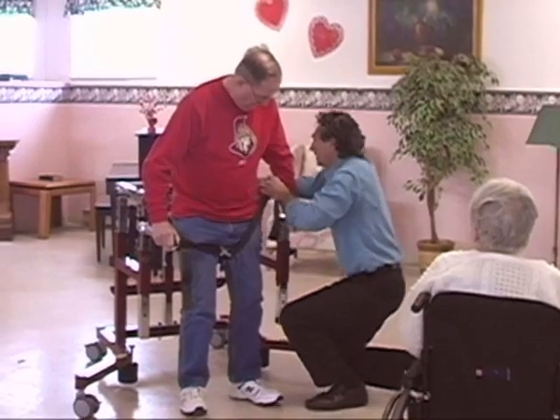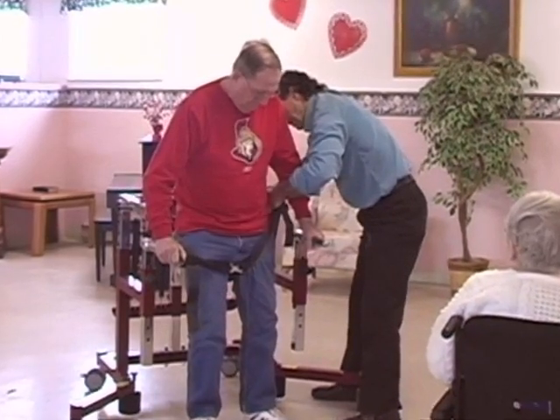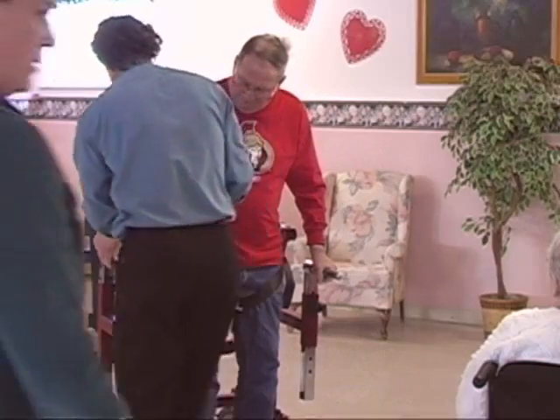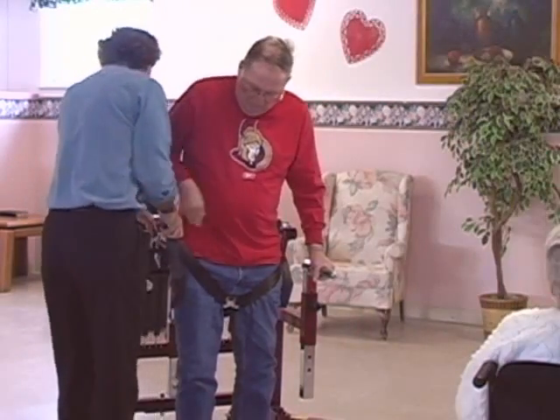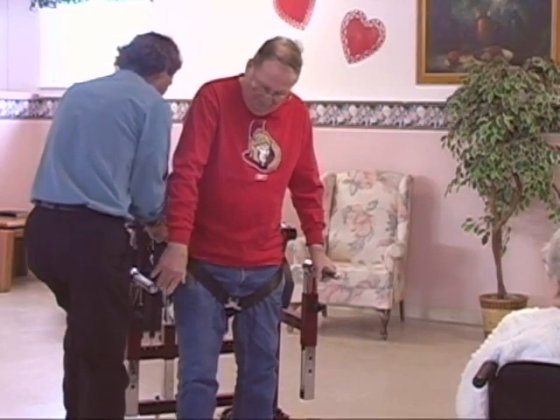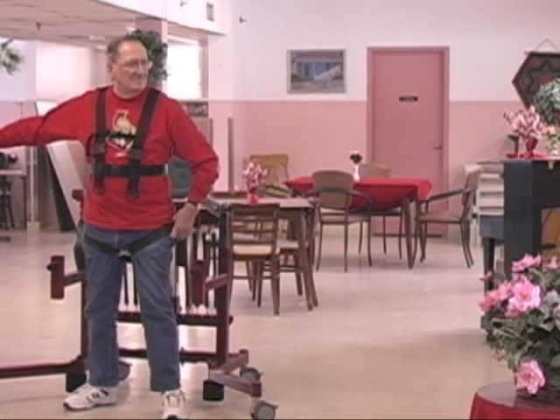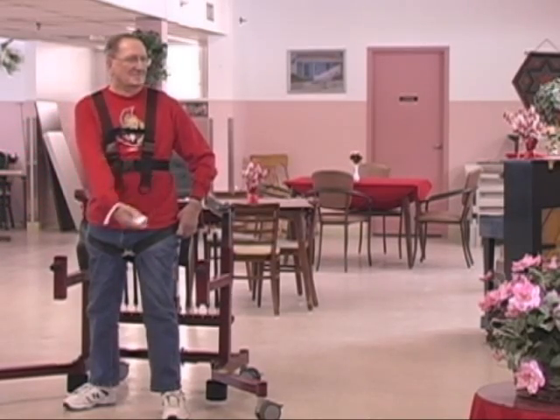Using the Bungie Mobility Trainer, typically only one therapist or aide is needed to train people with serious movement impairments, most of whom would require the support of two therapists under other circumstances. In many cases, the training can even be done independently.